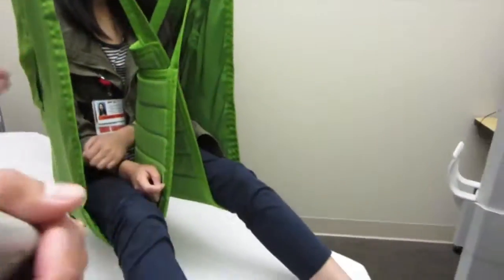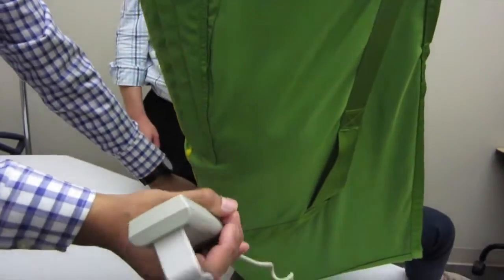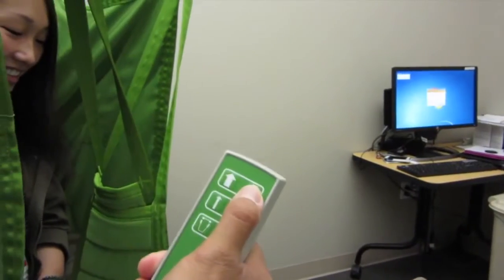There we go. You see the handles? This is why we had this placed this way, where the yellow line is at the back, because you have handles over here to help position them. All right, I'm going to go ahead and lower this down. Here we go. And center on the gurney.